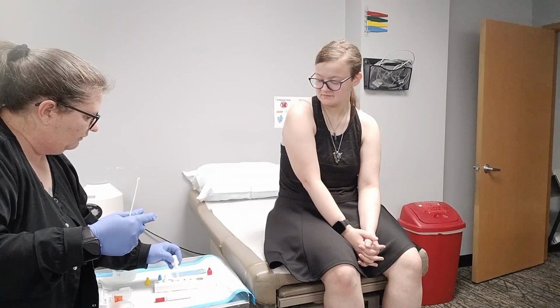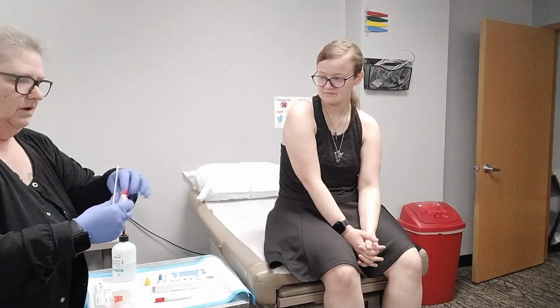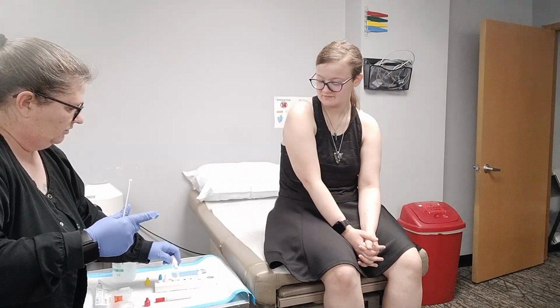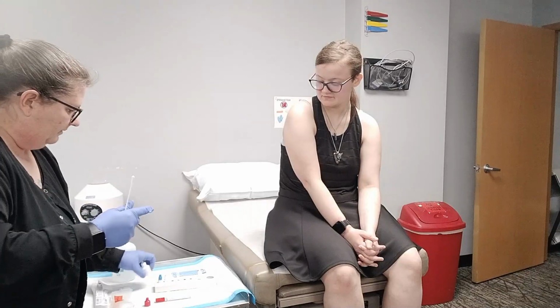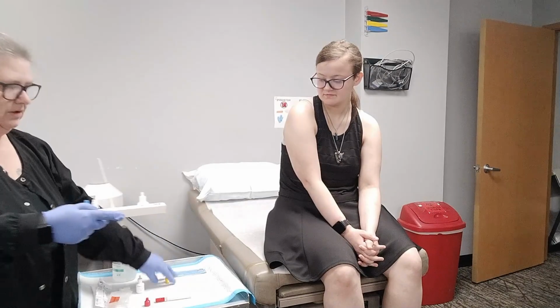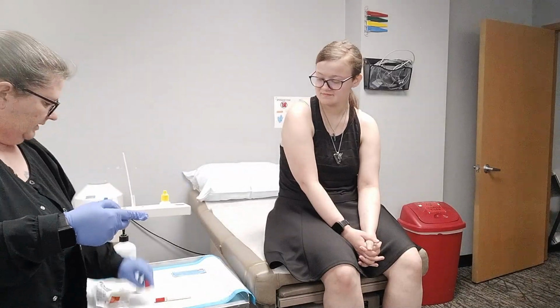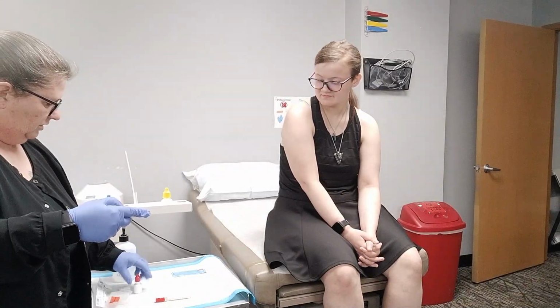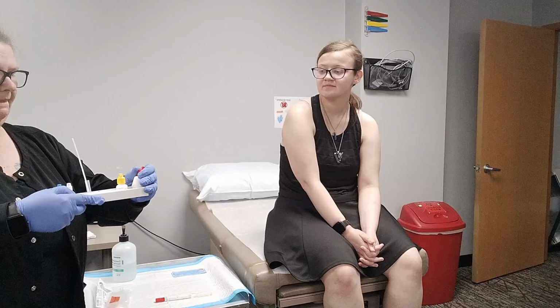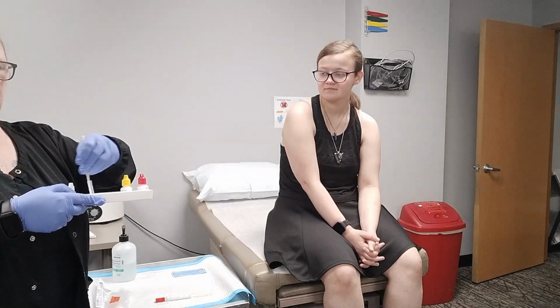One, 2, 3, 4 drops of the yellow. One, 2, 3, 4 drops of the red. And then we will put that swab right into our little test tube there. Okay, let me go ahead and get these lids back on so we can secure those. All right, and we're gonna let that sit for just a second. We're gonna go ahead and swish it around a few times.